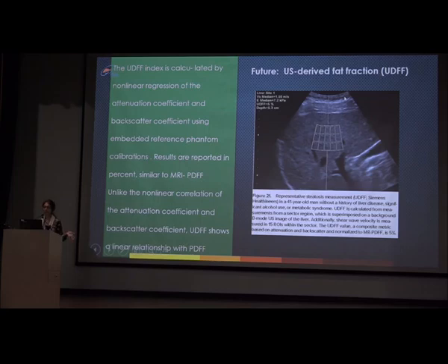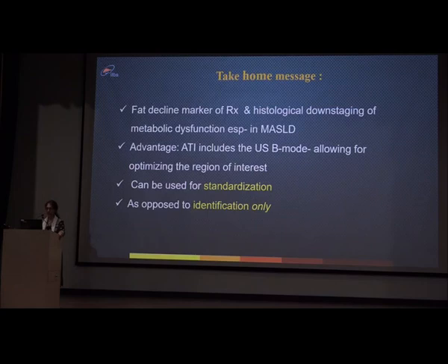You don't need to put the patient through an MR. It's a non-linear regression of the attenuation coefficient. They use backscatter, which means when you send the waves out, there is a backscatter as well, which hampers the attenuation value. So putting all that together, there is a multi-voxel approach applied in the liver on ultrasound, and you get values in percentages that show a linear relationship with PDFF. So slowly and surely you will be replacing MR-PDFF with the ultrasound-derived fat fractions. So that's all we have to learn from this new technique.